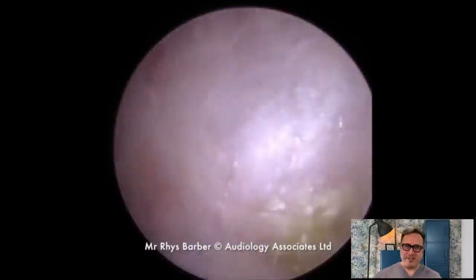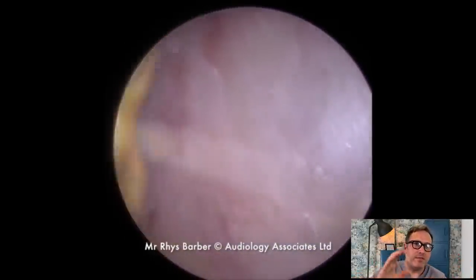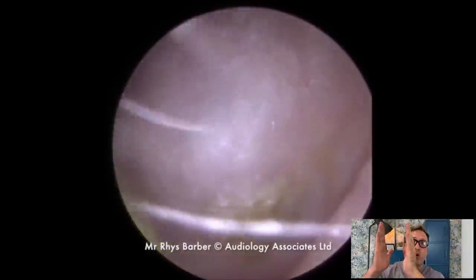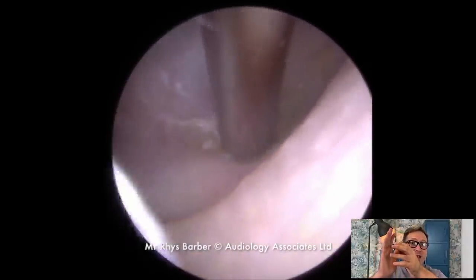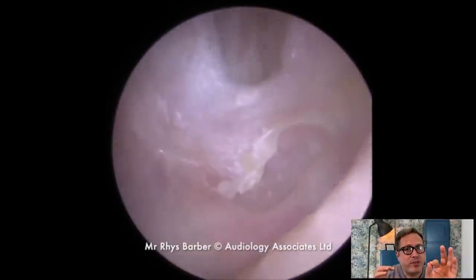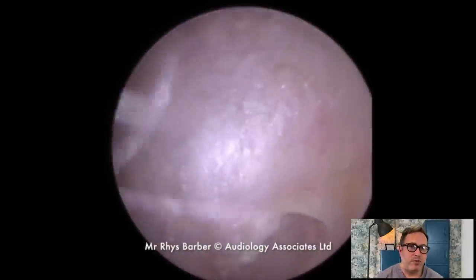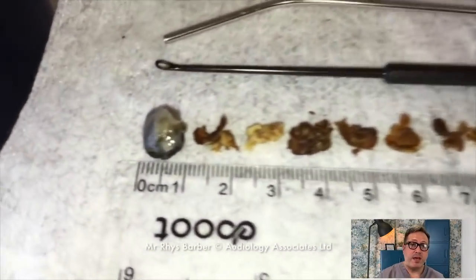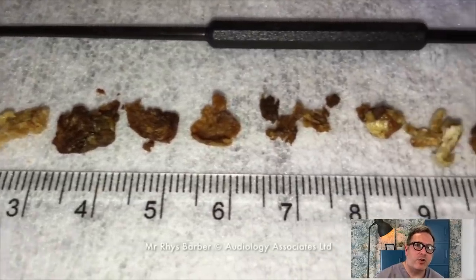This is what they call a false fundus. Basically what we have here is the canal skin has grown and met the skin on the other side. If you imagine this is your eardrum, your ear canal goes all the way down there, and this layer of skin is in front of the eardrum — quite a long way in front. So that's a piece of skin with its own blood supply. It's effectively like having your finger stuck in your ear because it's really going to dampen things. The difficulty is you can't get rid of that in clinic — that has to be done in the ear, nose and throat clinic because they have to cut that away and expose what's behind it. What's behind there could just be a standard ear canal — we've got no idea. The GP would refer to ENT; they'll do an MRI scan, check it over, and have it removed.